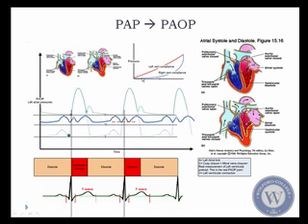Now, what's nice about left ventricular compliance in comparison to the right, because it has decreased compliance, is that it causes a much more linear relationship. So for a small change in volume, you see a significant change in pressure. One of the things that's nice about measuring PA occlusion pressures is that as you begin to tank somebody up with fluids, you can actually see the pressure change rapidly on your PA occlusion pressure. Versus in the right ventricle with the CVP, you would not necessarily see that until the person is on the upper end of the curve over here, which might be too late, and you may be pushing the patient into failure at that point.